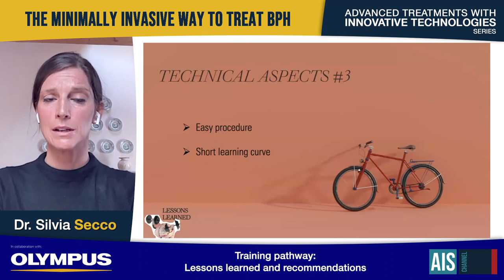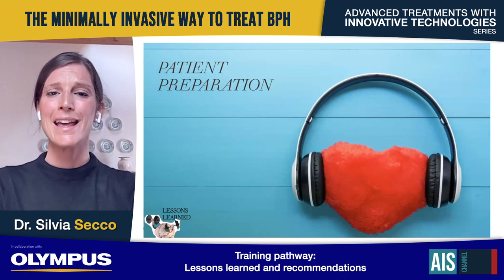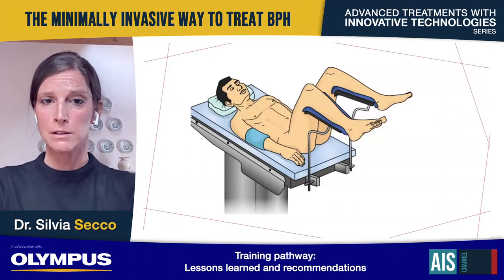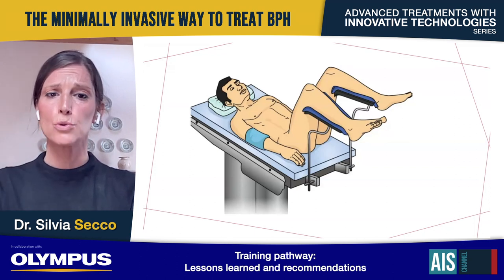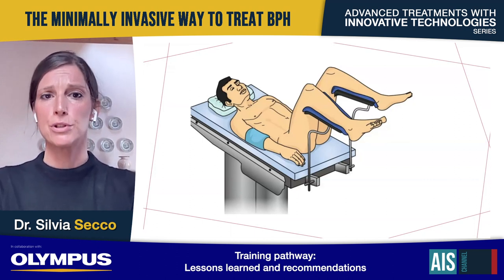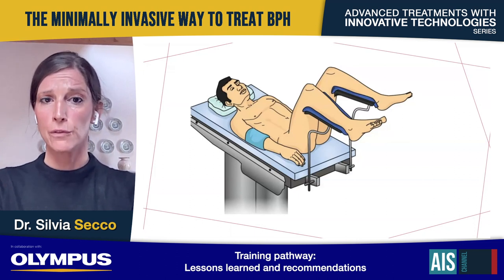Now other lessons learned. It's necessary to carefully take care of the preparation of the patients. Every detail, every aspect, even more if the procedure is performed under local anesthesia. The surgeon has to be in charge of everything, including the patient's position on the bed. Remember to carefully check if his head is comfortably placed to avoid abdominal or pelvic contraction that might make the procedure more uncomfortable. We have to make the patient comfortable.